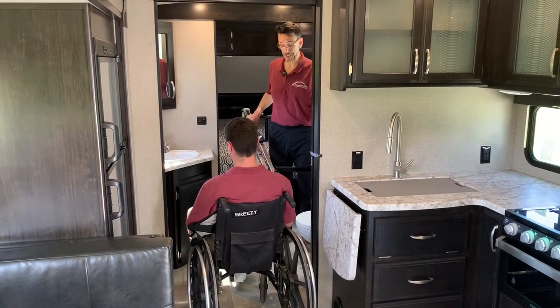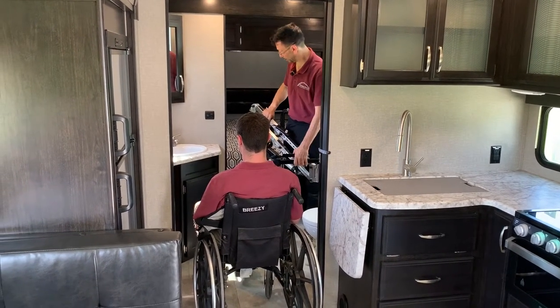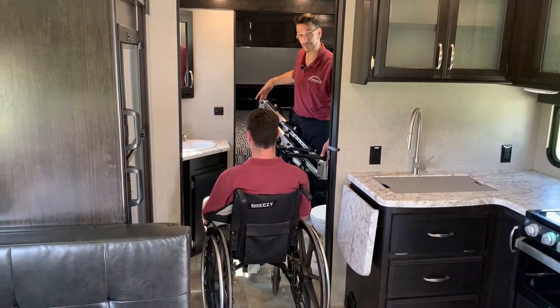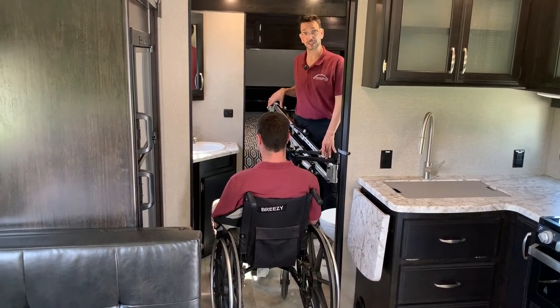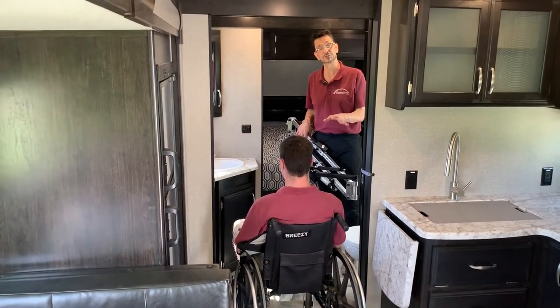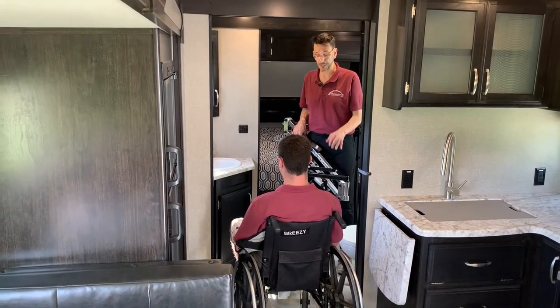The Multilift is a personal transfer lift system designed around the unique concept that one lift can do all of your lifting and transferring. This same Multilift was used to bring the user into this particular travel trailer, which is a Grand Design 2500, but it works on lots of different models.